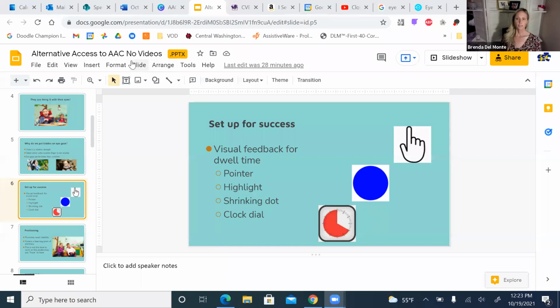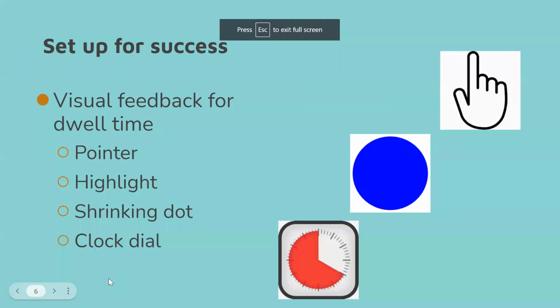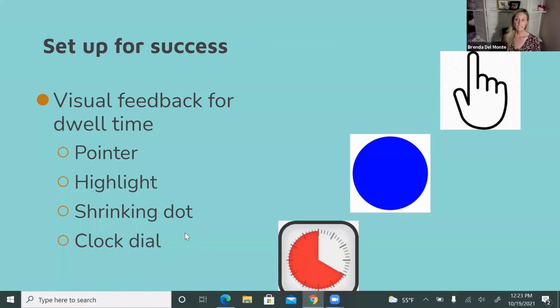But the video that I made on the YouTube channel shows all of the settings, and there's a lot. Once you're set it works, but there was a lot to make that great. And that's just with what program on the iPad? With any iPad. It's through assistive touch. It makes the entire iPad accessible through eyes. So I instantly had somebody hit the assistive touch, get out, open up the YouTube icon, and play a video.